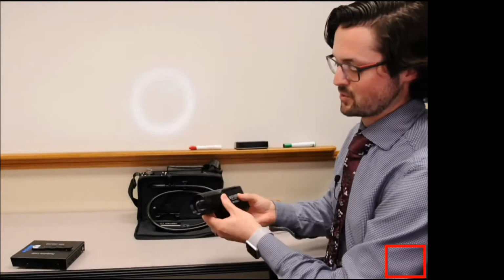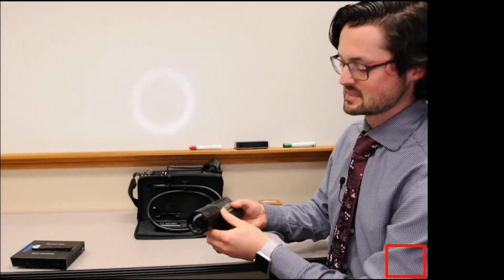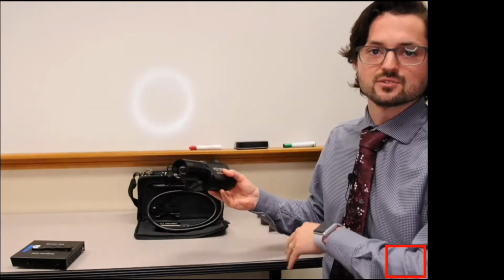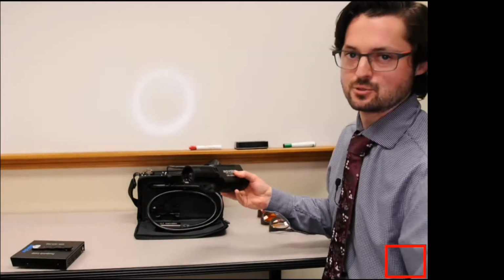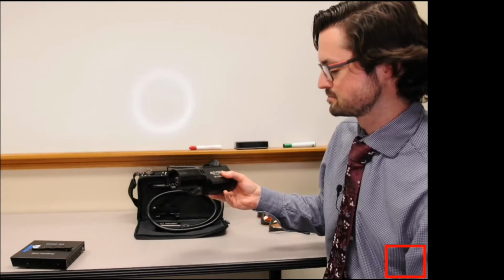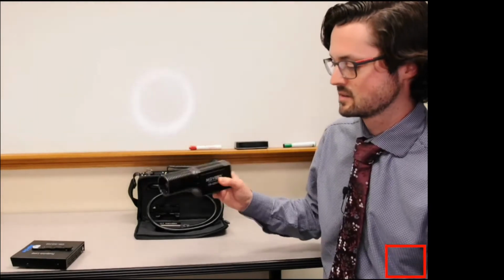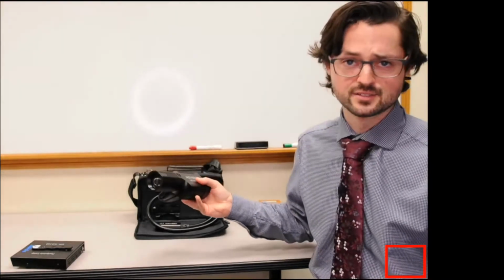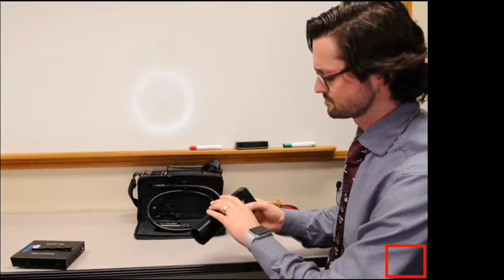And the reason this whole thing's made of metal is because it's actually kind of clever. The whole thing is a heat sink. And so that allows the LED to keep cool, allows you good operating times, that type of thing. And it also allows the company to make it fanless, which is something that's kind of nice.